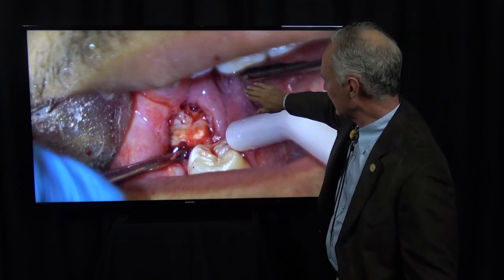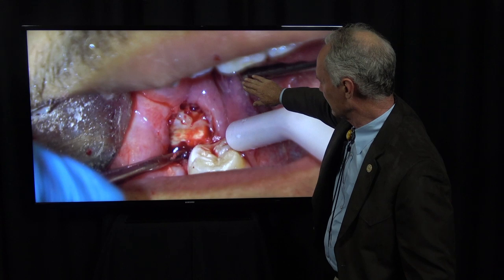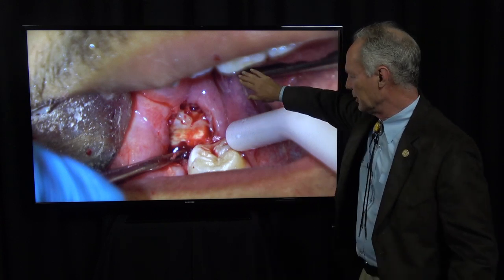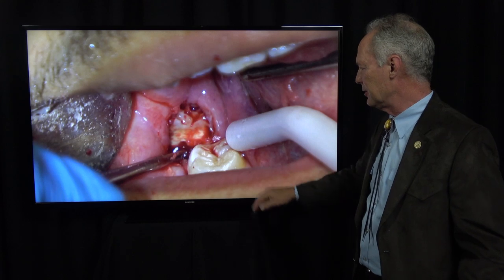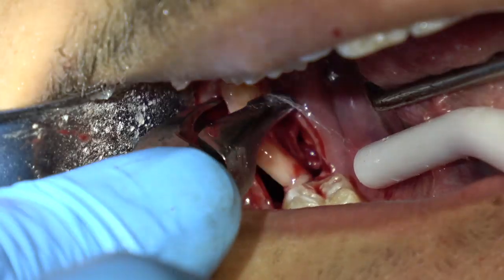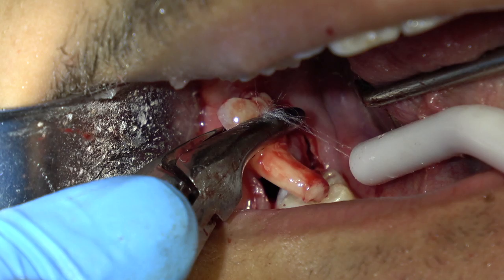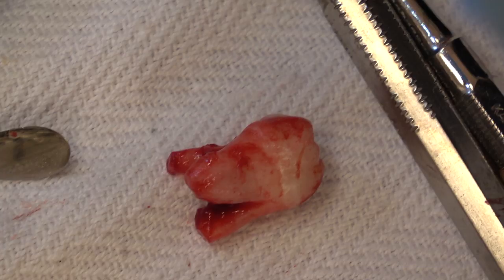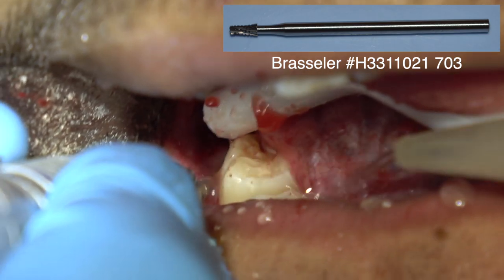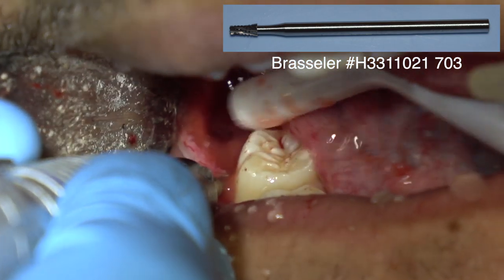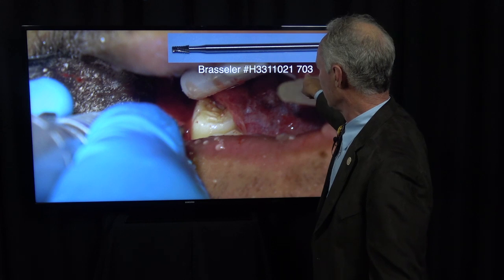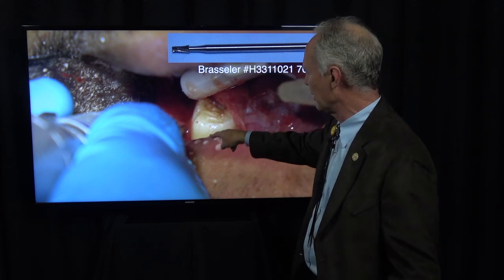Be sure you're protecting the airway and guarding with a mirror or a 2x2 so the patient doesn't aspirate the piece of tooth. Here it comes — removing that distal part with the rongiers. Here's the mesial part, and I'm drilling a hole into the mesial part with this 703 long shank surgical burr.